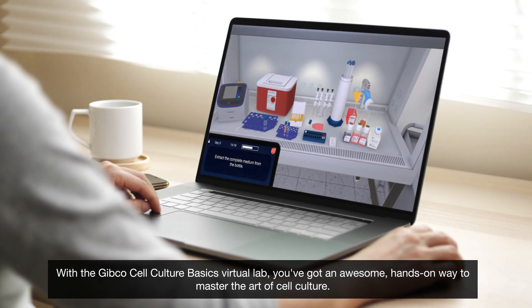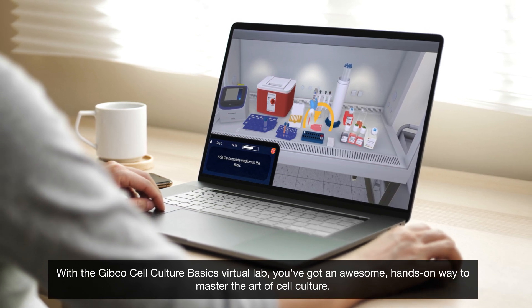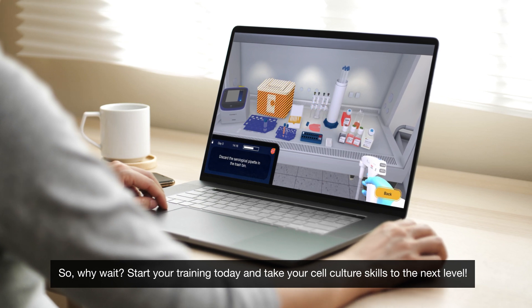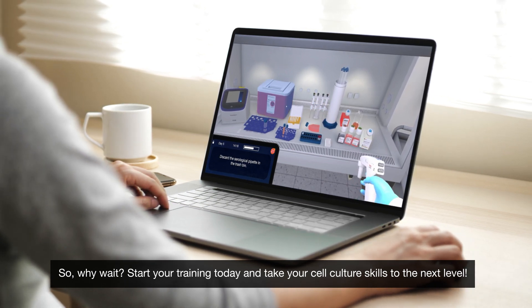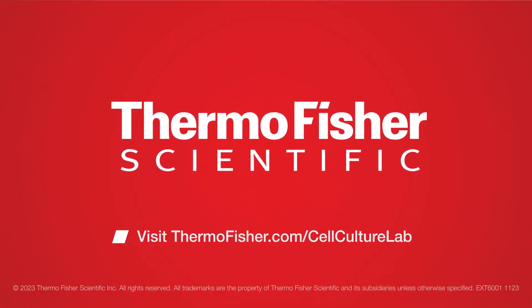With the Gibco Cell Culture Basics Virtual Lab, you've got an awesome hands-on way to master the art of cell culture. So why wait? Start your training today and take your cell culture skills to the next level.